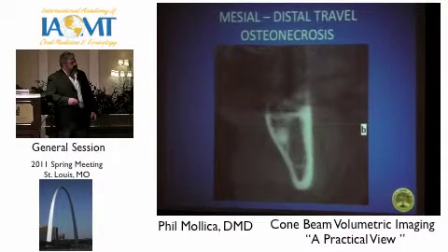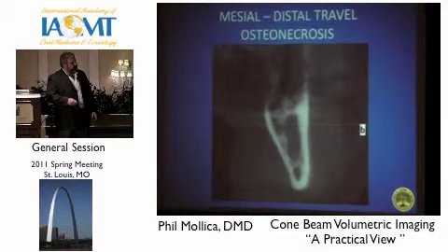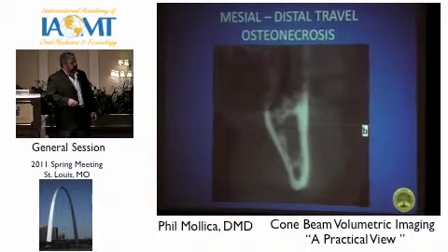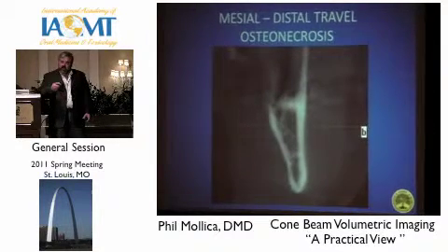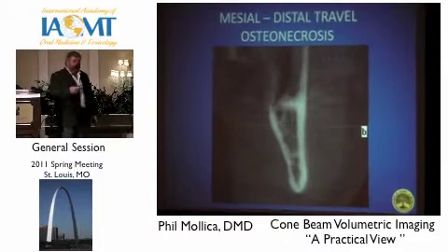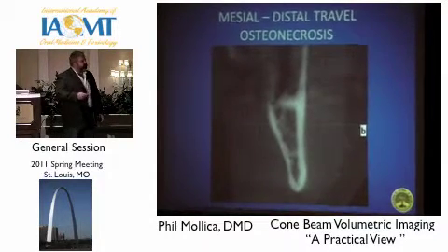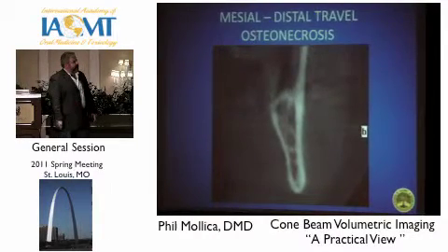As we're working our way back, we're starting to see the remnants of the rami of the mandible itself. Here itself, and then it starts to clear out a little bit. So now we're thinking three-dimensionally. How do we measure these things? We can at least visualize this and get a sense of what we're doing. And once again, we're starting to get some compactness here.